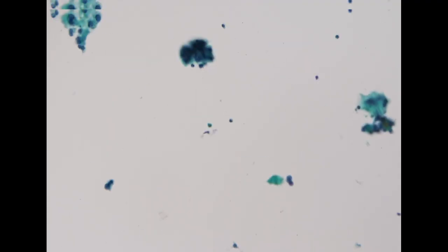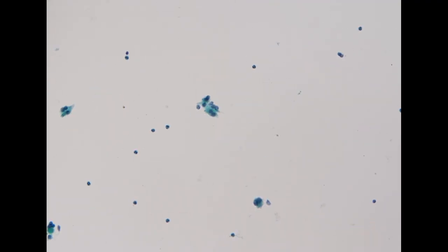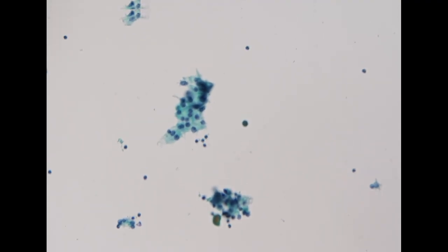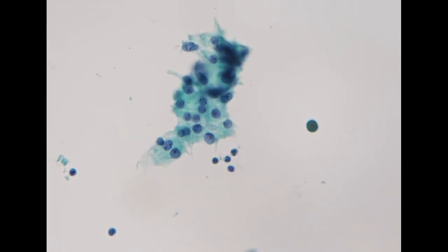The diagnostic criteria are very different for well-differentiated follicular pattern thyroid tumors. In America and other Western societies, some people will call these papillary thyroid carcinoma. But here, because we tend not to call them RAS-positive papillary thyroid carcinoma, I think this is still a follicular tumor.